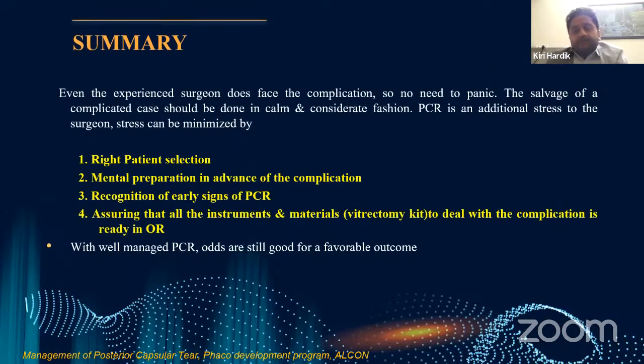So just before I conclude, even an experienced surgeon can have the complication of posterior capsular rupture. The main thing is not to panic, and most cases can be managed very well with a good outcome. PCR can cause stress, but this stress can be minimized by right patient selection, mental preparation, and recognition of the earliest signs, which will lead to early management and prevent further complications.